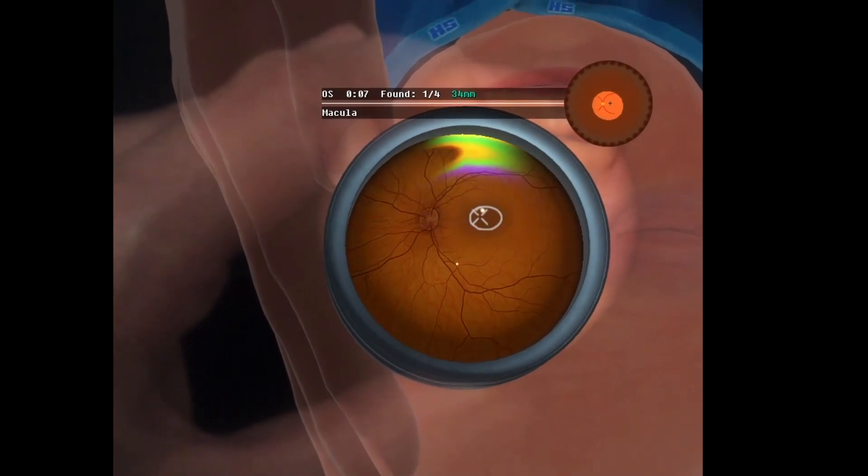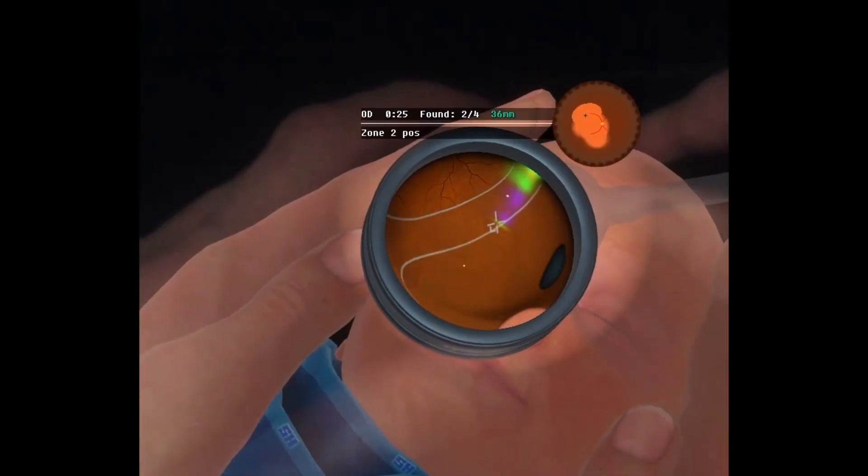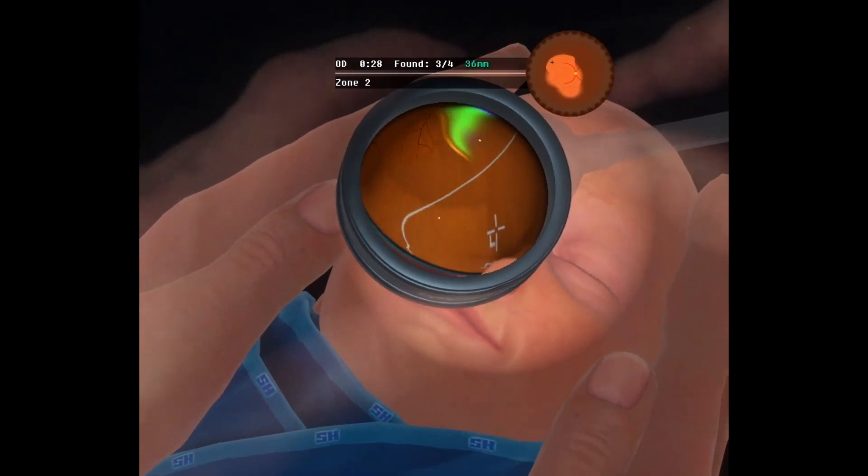The IC Indirect ROP teaches the main characteristics of ROP and how to recognize the different zones and stages.